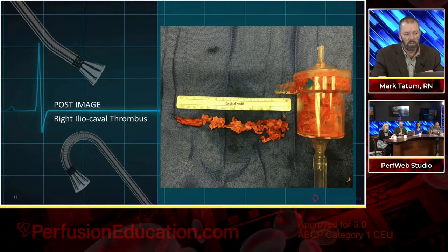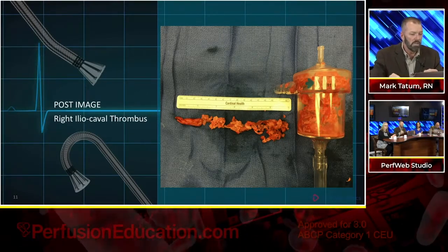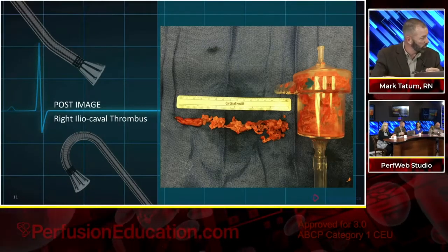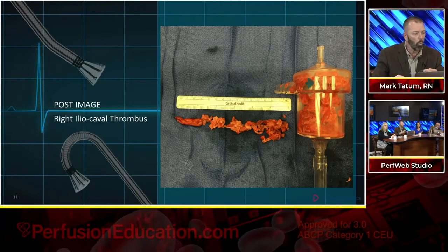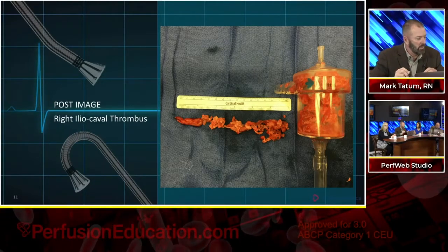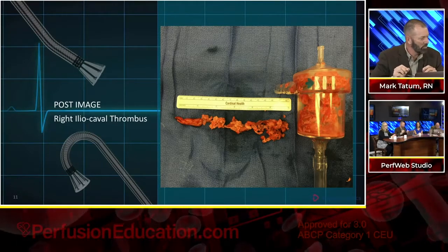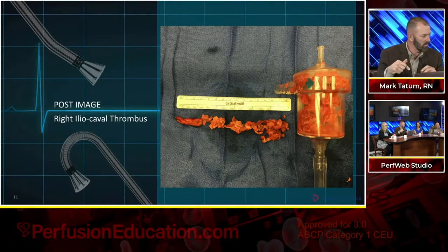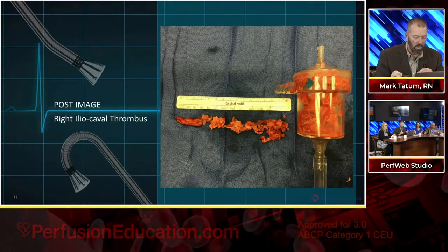Fortunately, many of the cases that we've done to date have shown this, and we've gotten a great result out of these. We got not only the fresh thrombus, but also some of the material comes in that has a much more chronic presentation. One of the options that I believe you had in your poll was, should you use lytic therapy? We may have talked about that for just a second. We'll go back to this during the discussion and talk about lytics in this presentation and what we think may have happened.